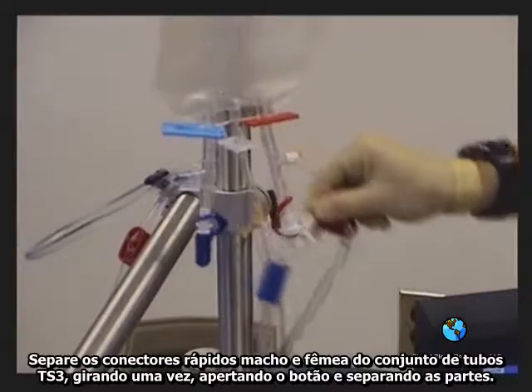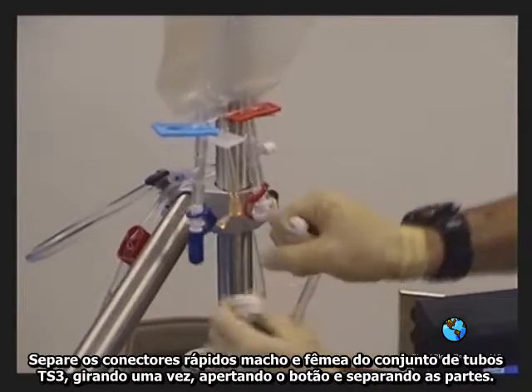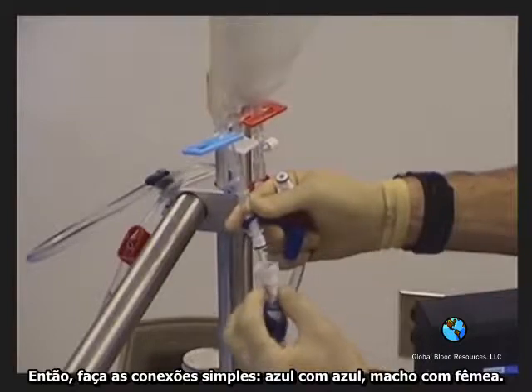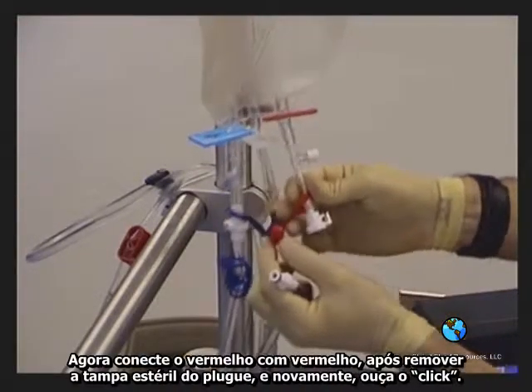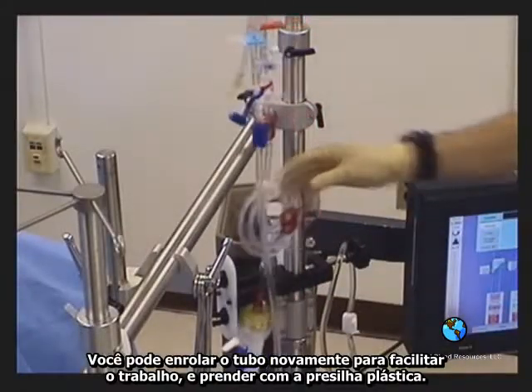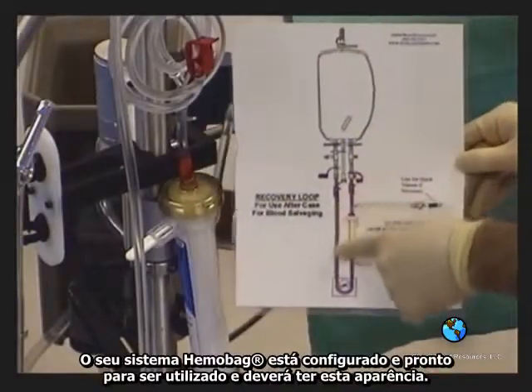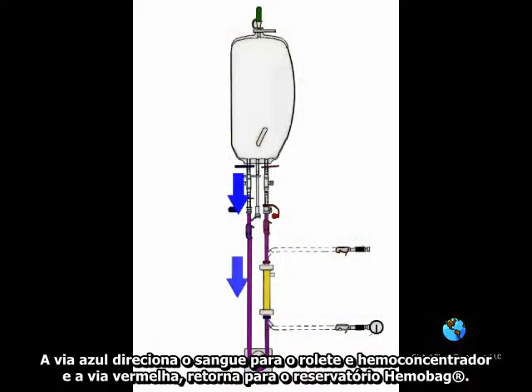Separate the TS3 tubing set's quick connectors by twisting once and then pushing the button and pulling apart. Then it's just simple connections, blue to blue, male to female. Be sure to keep your fingers away and hear the click. Now connect the red to the red after removing the sterile plug cover cap, again listening for the click. You can wind up and tie band the unused top portion of the standard loop to keep it out of the way. Your complete Hemobag system is set up and ready for use and looks like this. Blue out to the roller pump and hemoconcentrator, and red returning to the Hemobag.